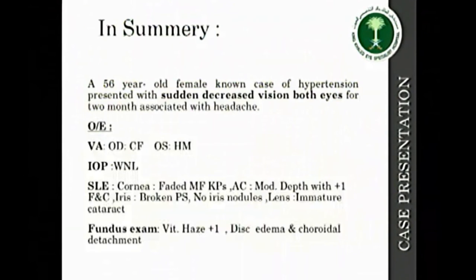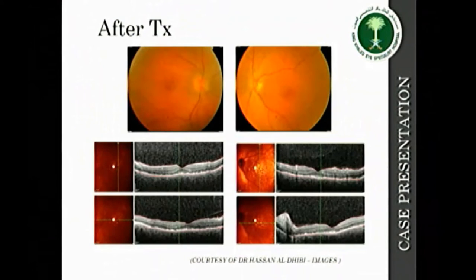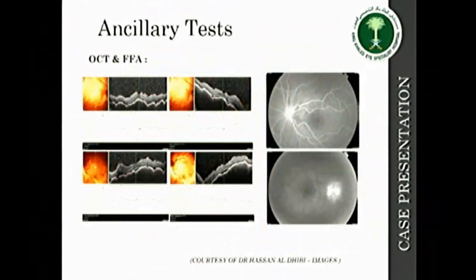Posterior scleritis should present with deep-seated pain, which is important, but in this case the patient has been treated with steroids, so that might have masked the symptoms. Look for the choroidal folds and the subretinal fluid. In the fluorescein angiography, there are deep-seated hypofluorescent lines radiating from the disc. Put it in your mind: when you see something like that, think about it. Then look at the ultrasound. What did they say in the ultrasound?